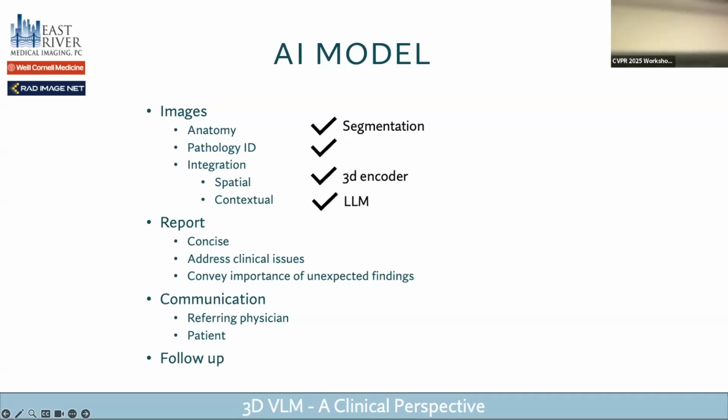Does a pretty good job with LLMs, right? If I give LLMs a few symptoms or a few findings, it can oftentimes do a pretty good job of coming up with a potential diagnosis. It's not perfect, as we saw in some of the previous lectures, but it's getting better, and people are coming up with different mechanisms to make it better. Report generation, super easy with LLMs. I actually use LLMs in my daily practice to help me put together reports, to check for typos in my reports. So that's easy. It's in use today.